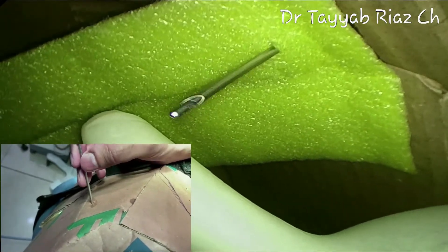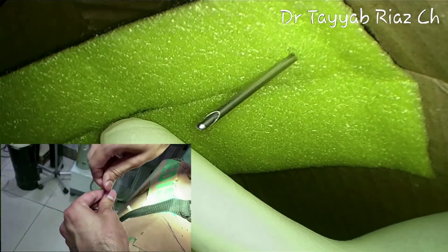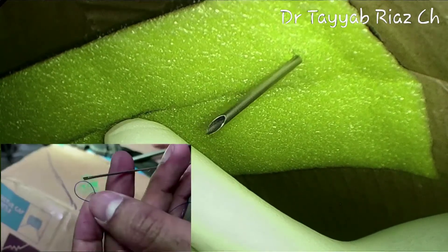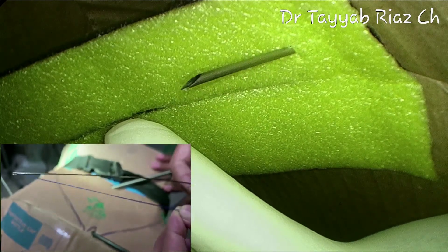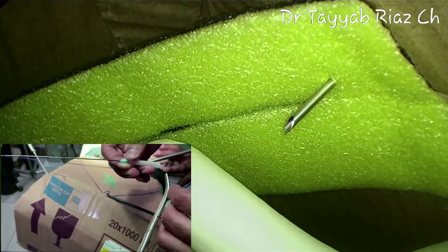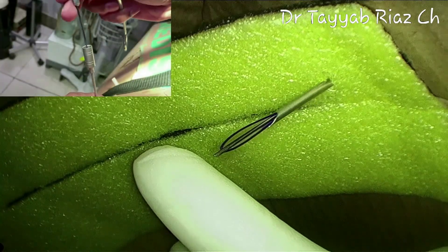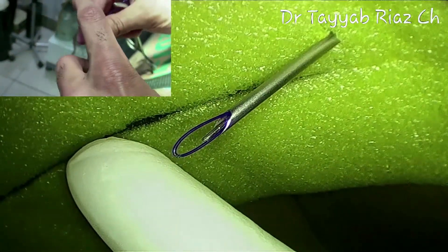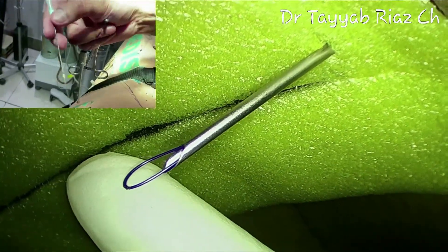I am inserting the Veress needle at a point in the right iliac fossa where maximum handling of the appendix can be performed. After passing the Veress needle, I am removing the inner stilet part. Then, as previously shown, take a loop, feed it to the groove of the loop passer, and grab it with artery forceps for easy handling. Insert the loop passer into the Veress needle until sufficient loop has reached inside the peritoneal cavity out of the lower end of the needle, then remove the loop passer.